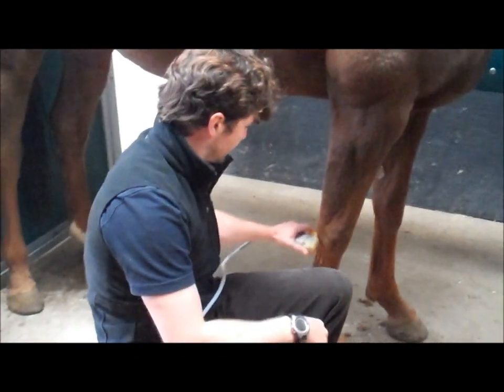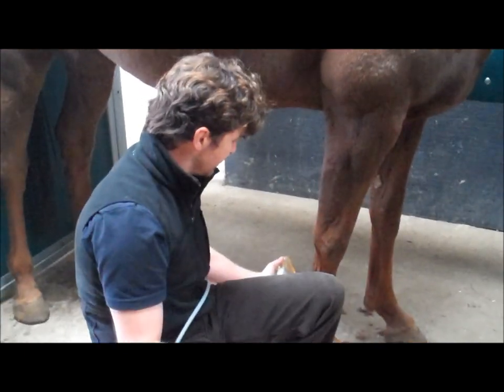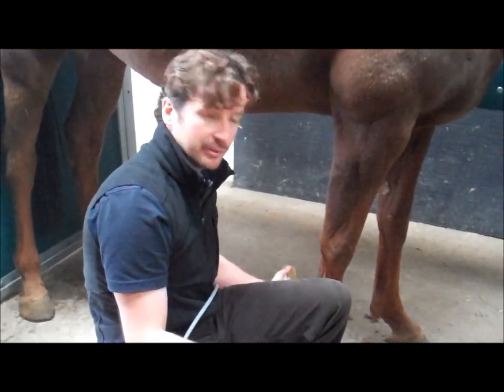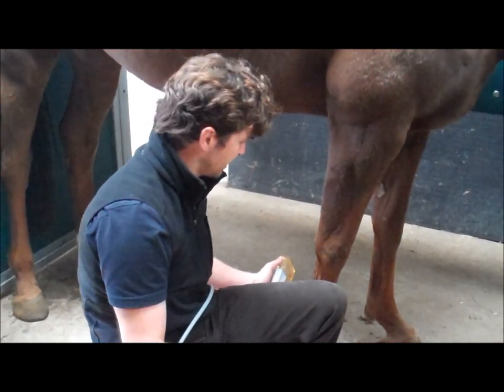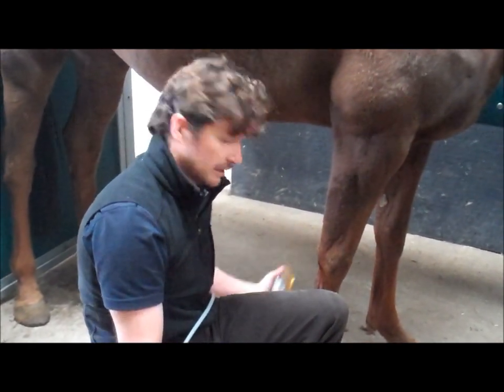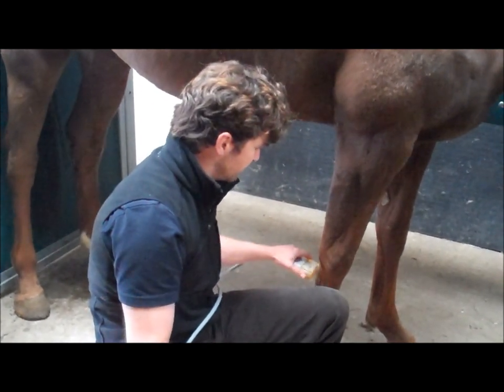This is very much a scanner. We've done a little bit of preparation for the leg — not a great deal. I could take a lot more hair off, but clients don't like you necessarily shaving them too close to the skin. Some mares react to that a little bit as well. A little bit of a wipe down with some scrubbing spirit and a soaking with some lube.